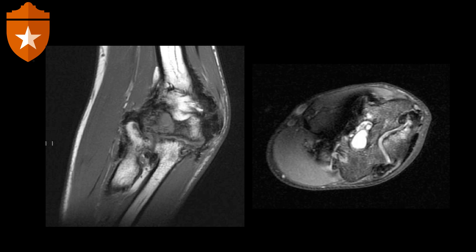On this patient, we obtained an MRI with T1 and T2-weighted images, the T2-weighted images with fat suppression. Within the articulation, there are regions of decreased T1 and decreased T2 signal intensity with susceptibility artifact, related to hemosiderin deposition due to recurrent hemarthrosis. We can also see the bone destruction and erosions — a large erosion visible on both T1 and T2.